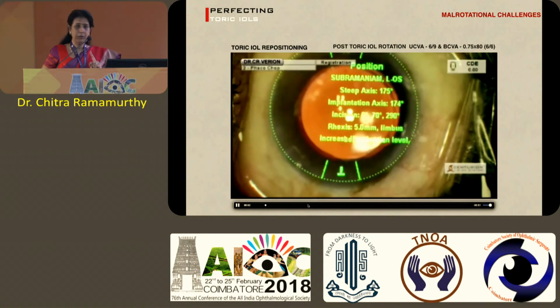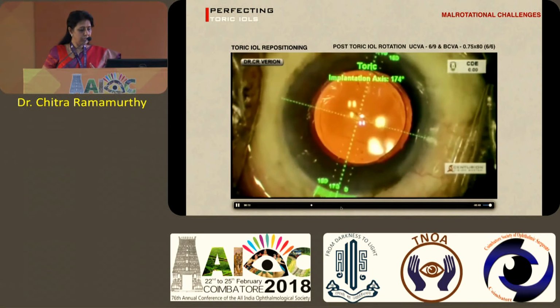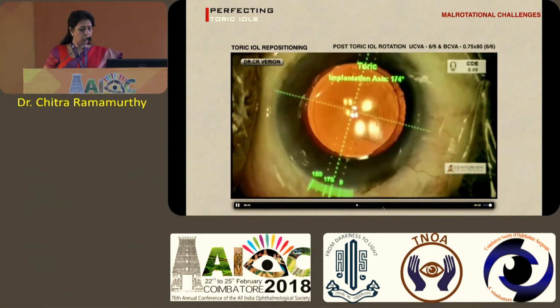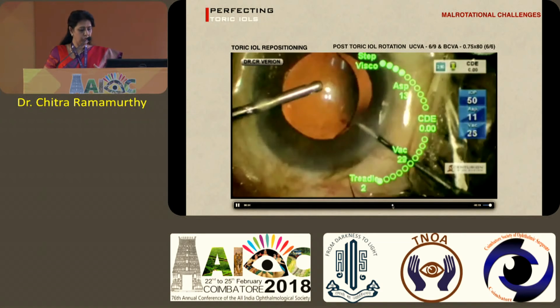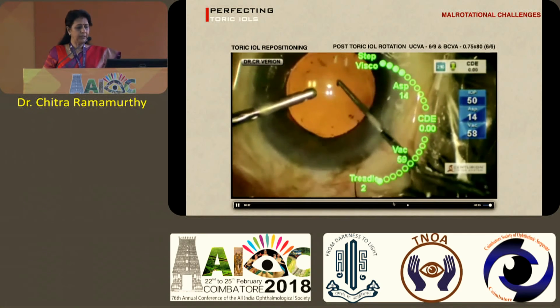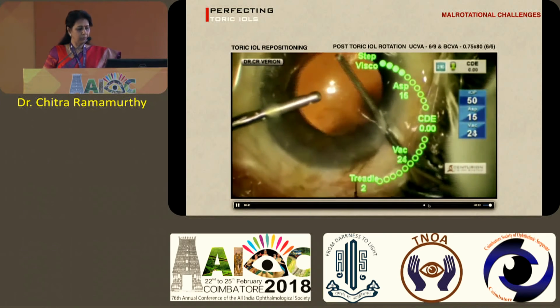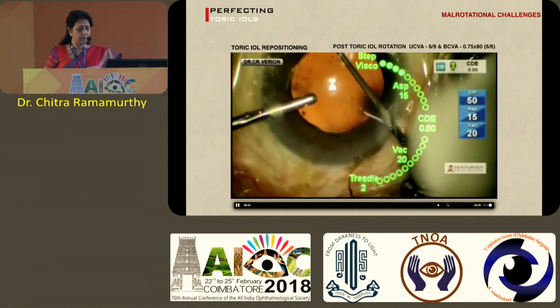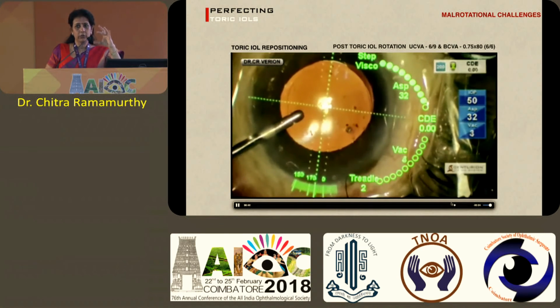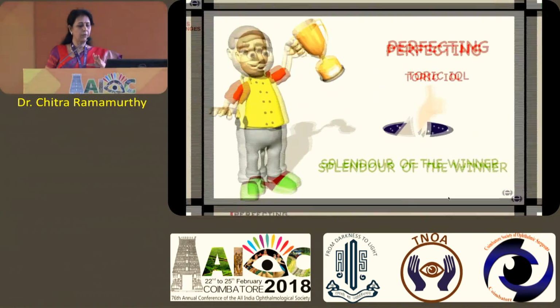You should remember not to inject viscoelastic; open the side port incisions and inject, and with the irrigation fluid on, you have already marked what should be the final IOL position, which you had gone wrong. So then you just gently separate the bag from the overlying capsular rhexis, position it optimally in that position, and then hydrate the wound. Even while removing the speculum, there could be a possibility of the IOL rotating. So finally see whether it's in the optimal position.